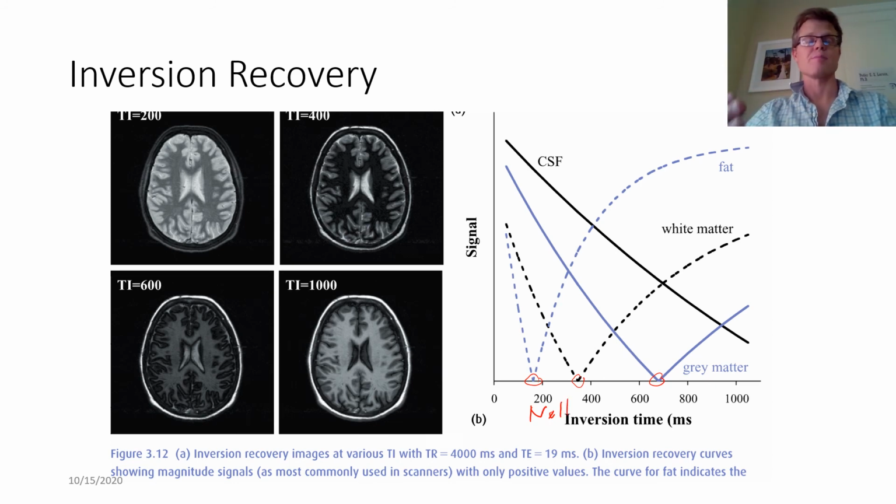And so we use this as a method of signal suppression by choosing carefully this inversion time and this TR time.